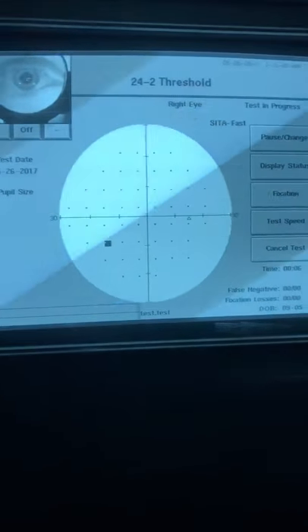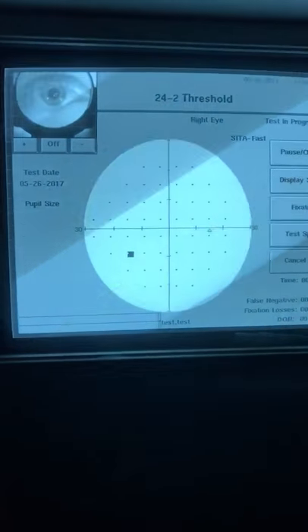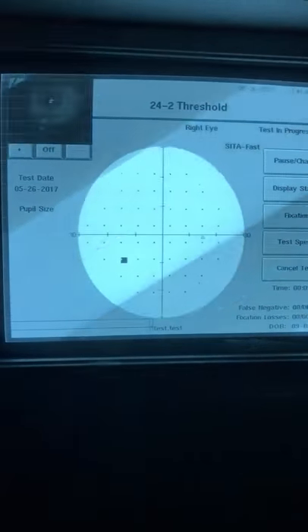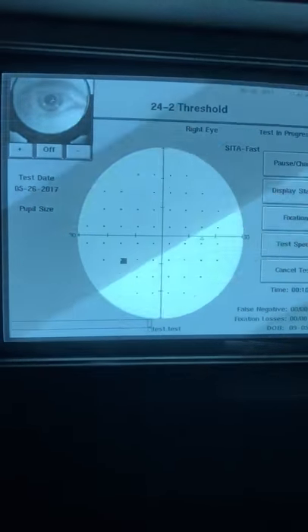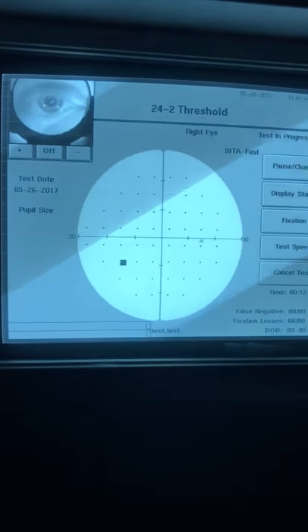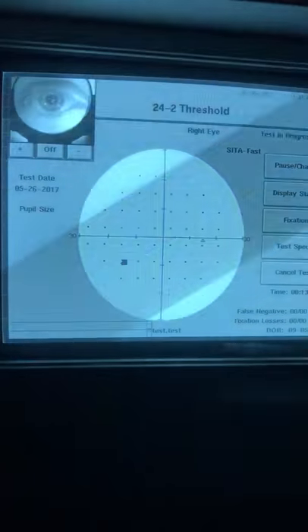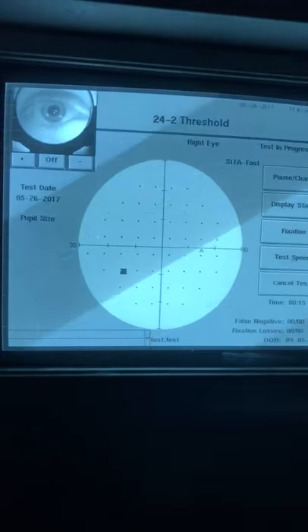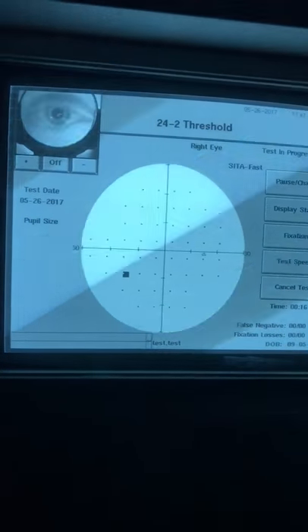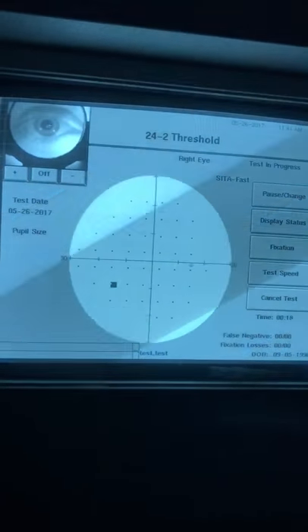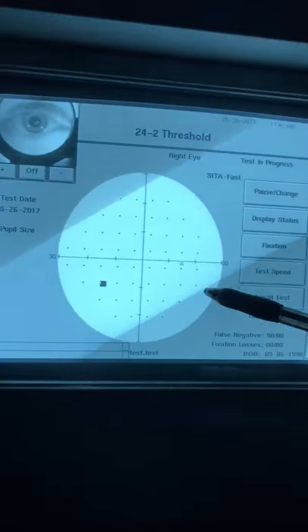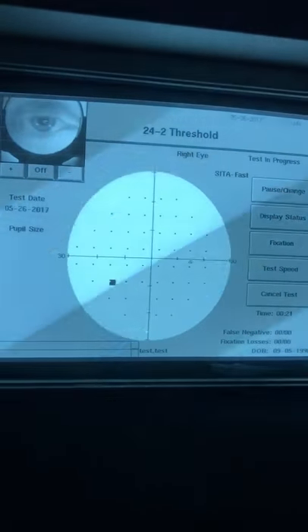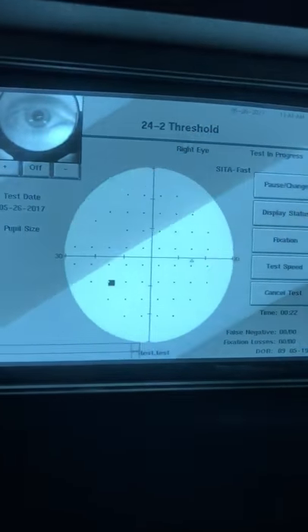During the test, you want to make sure that her eye is looking straight ahead at all times and she's not wandering around. The first part it's looking for is her blind spot. In the right eye, it's going to be right about here. The left eye will be on the opposite side.